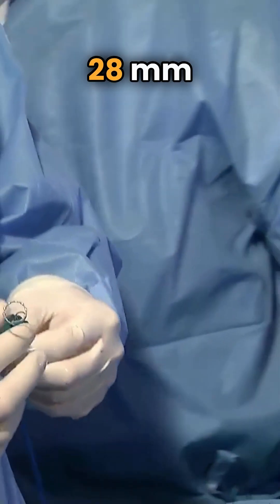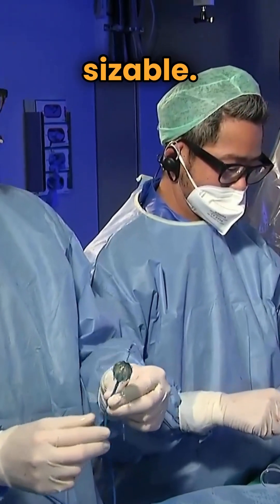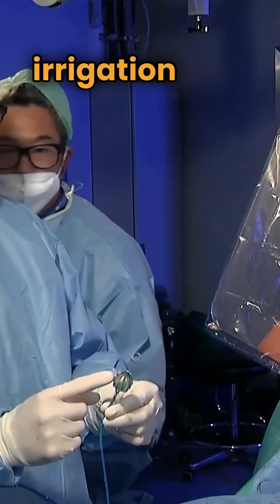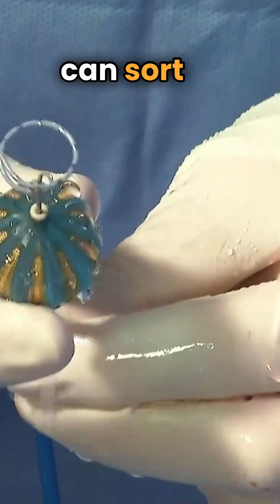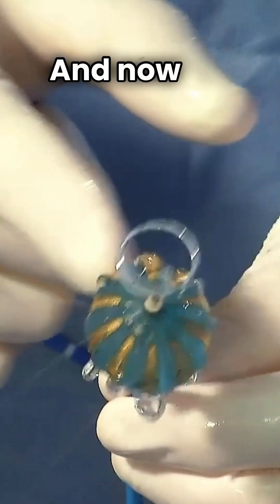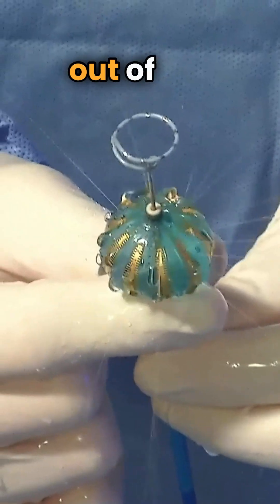The balloon is a 28 millimeter device and it's non-sizable, but by varying the irrigation flow during the ablation you can sort of change the compliance a little bit. Now it's fully inflated — you can see how the irrigation fluid is coming out of the electrodes. That is very impressive.